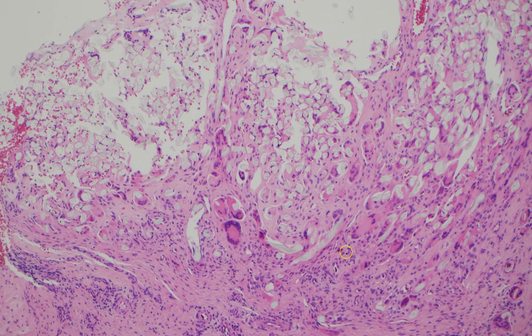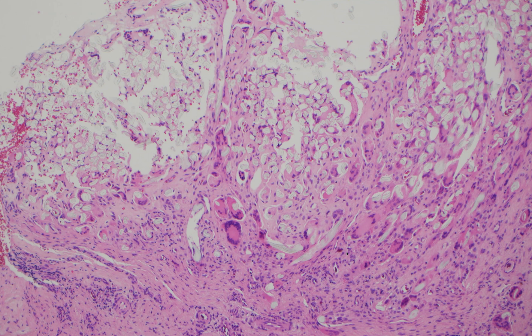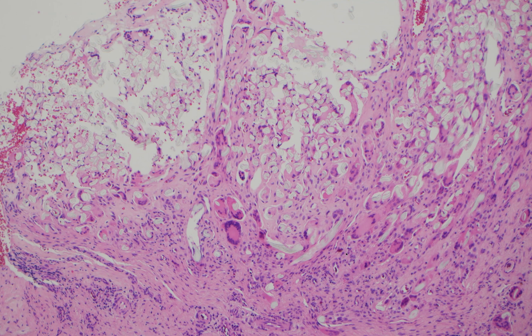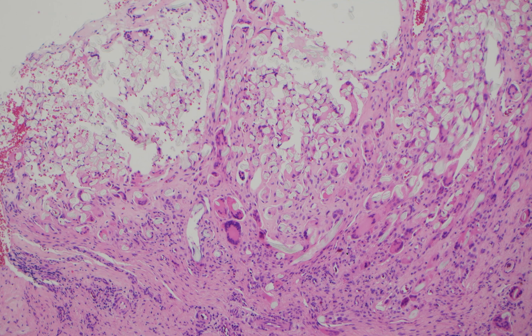Hi, I'm Dr. Jared Gardner, and today I'm going to show you a kind of cool incidental finding. This was from a foot amputation specimen. A patient had previously had a toe amputation, and there was a lot of scar and reactive change in addition to gangrene and necrosis and acute osteomyelitis — bone infection.